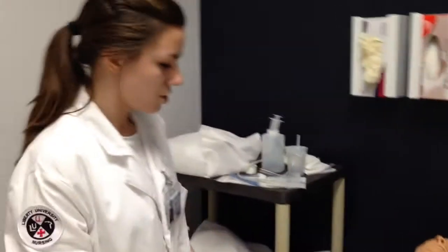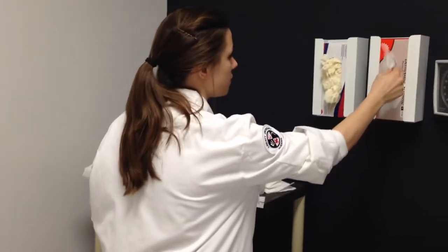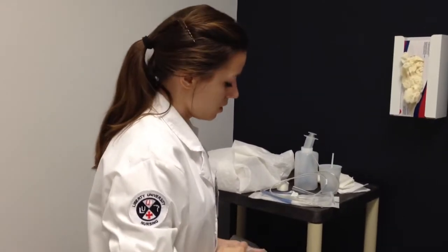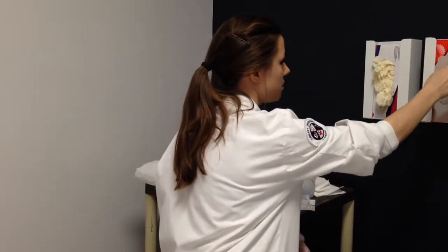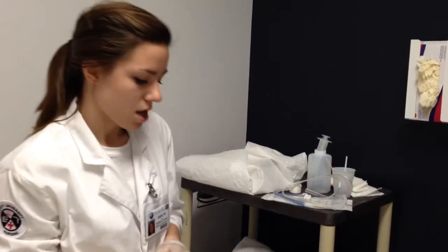Alright, so after I did your NG tube, I would perform hand hygiene, and put on a pair of clean gloves again. And what we're going to be doing is inserting your Foley catheter. So in order to do that, I'm going to raise the bed up to a level that's comfortable for me to work in.